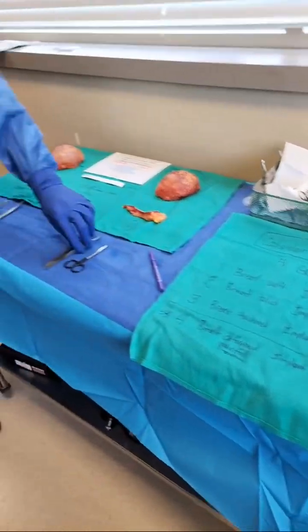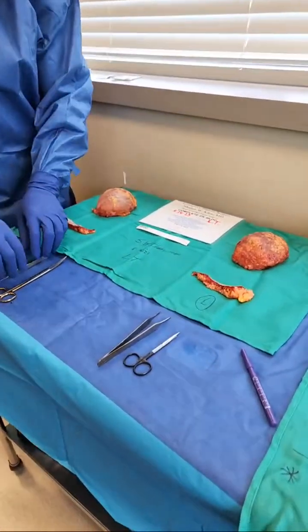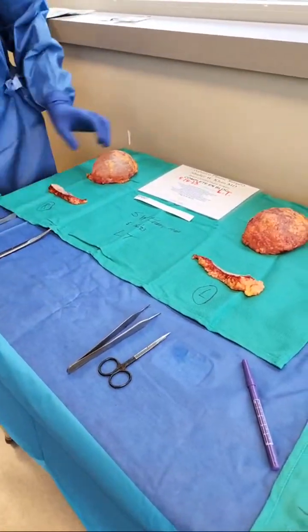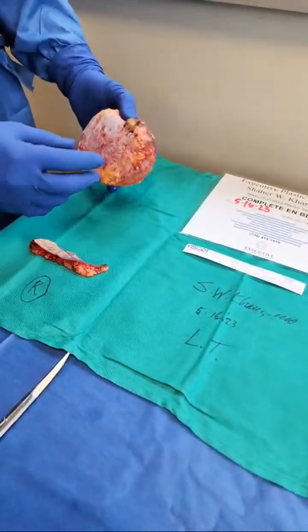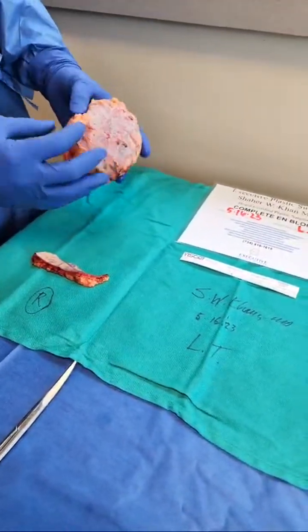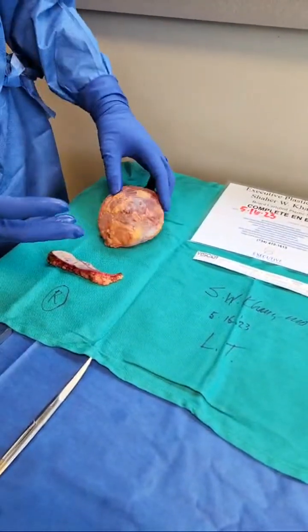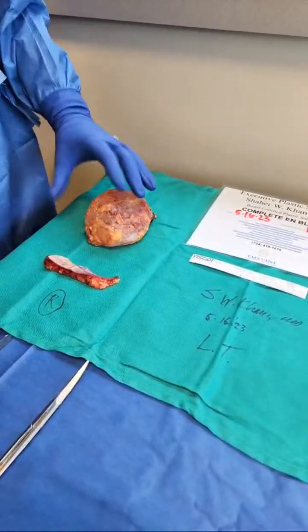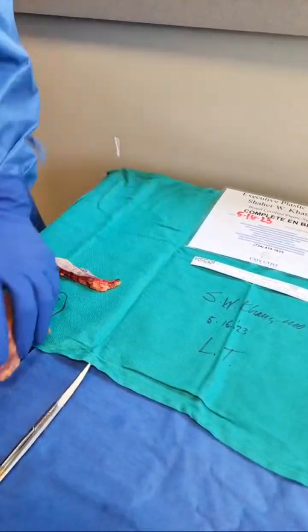So in this case, our patient had grade 4, and she was in a lot of pain and a lot of misery, and so hence her desire for removal of the implants that she just got in 2019. Now if you look at this, how it is compressed together, and you can see I removed that excess tissue that was on the side, also over here, and you can see how this capsule is thin, and how it compresses the implant so hard under so much pressure.